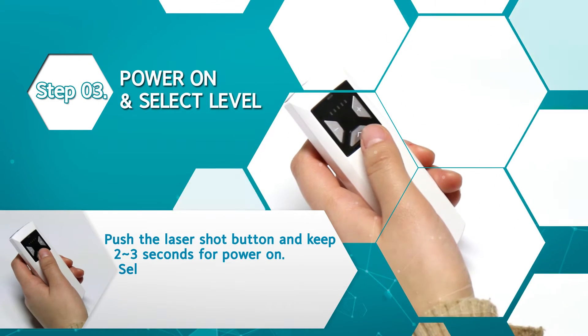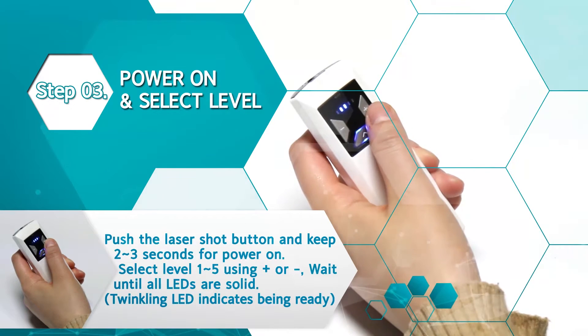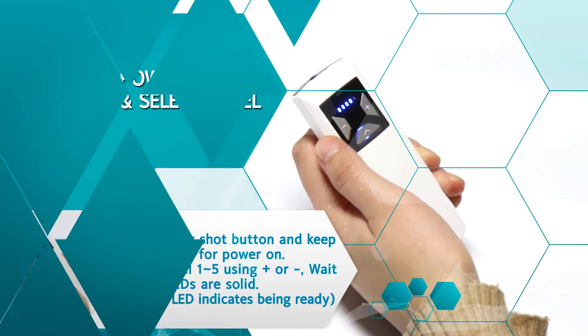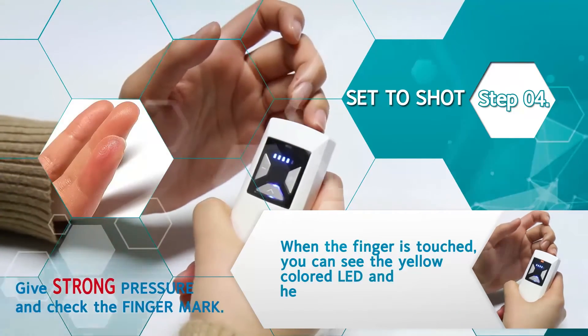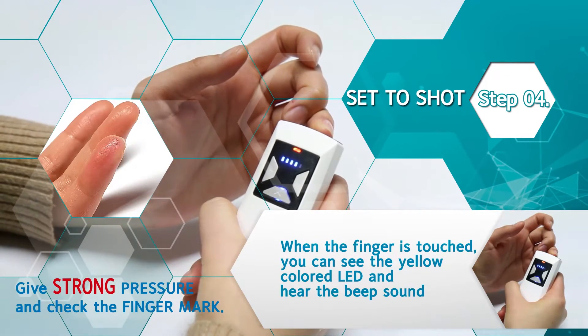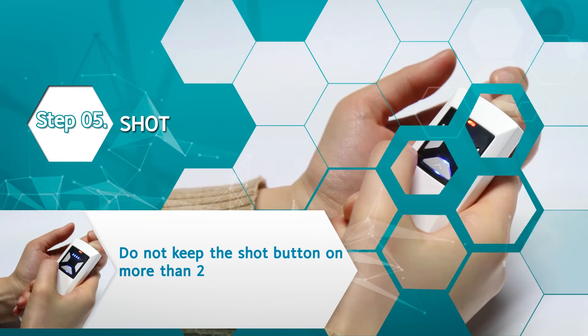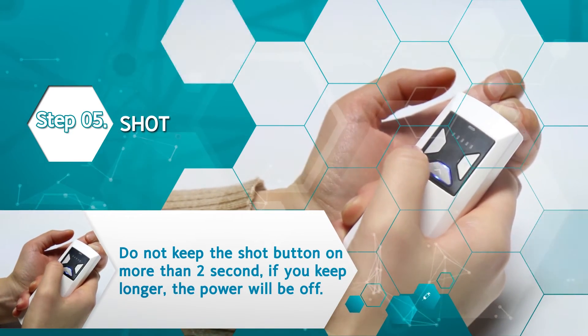Step 3: push and hold the laser shot button for 2 to 3 seconds to power on and select level. Step 4: touch your finger on the laser aperture to prepare shot. Step 5: touch the three-point safety spot concurrently and push the laser shot button just once.